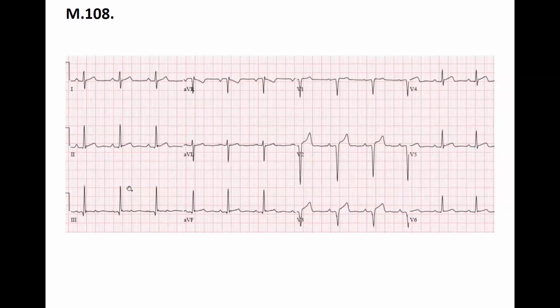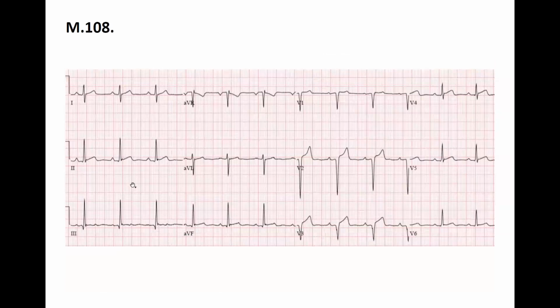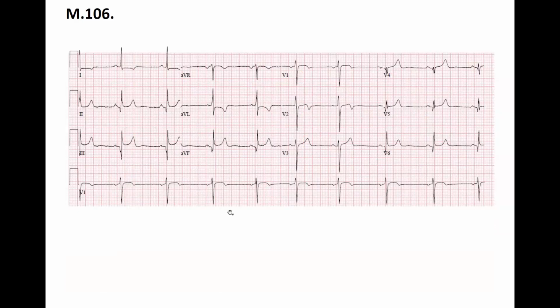Is it okay if I ask a quick question before we go? Why not? Anybody can ask a question. It was about the previous tracing 106, regarding the inferior STEMI. I remember in your videos you mentioned that we can detect if this was a previous infarction or if it's ongoing. So how do we know if it's currently new, or if it's an old infarction that happened before? Okay, very good question.